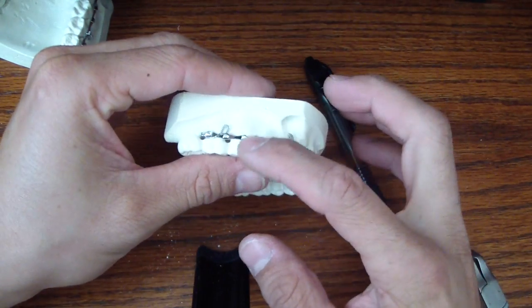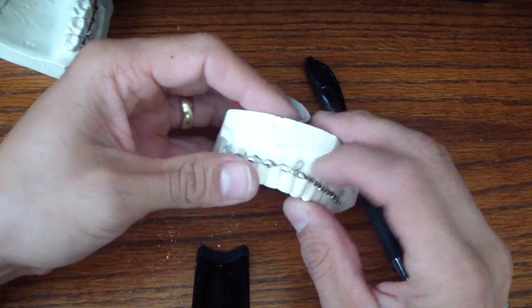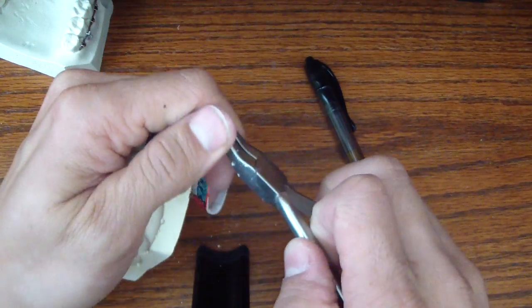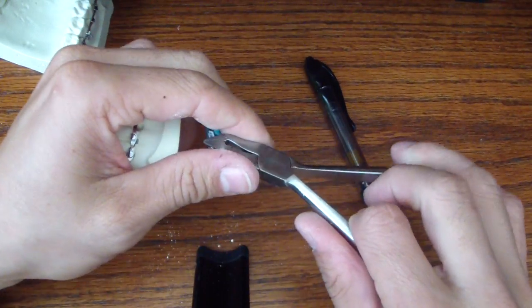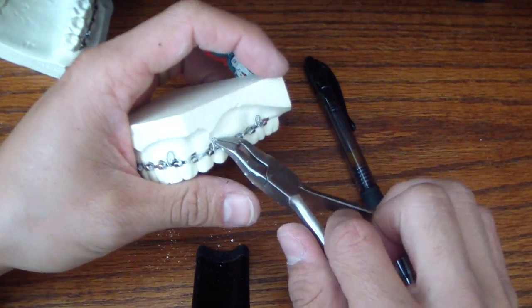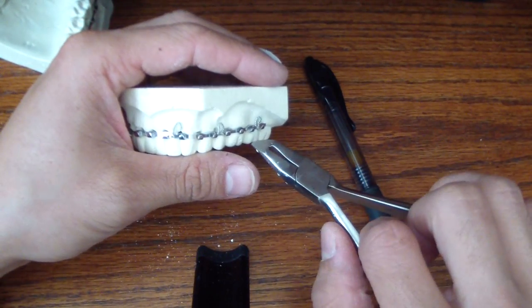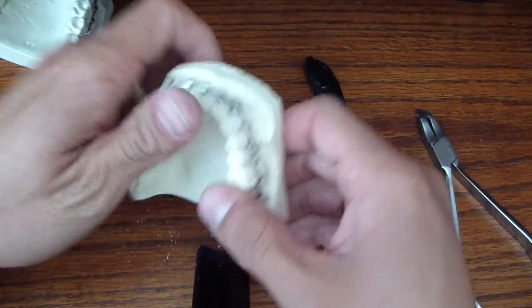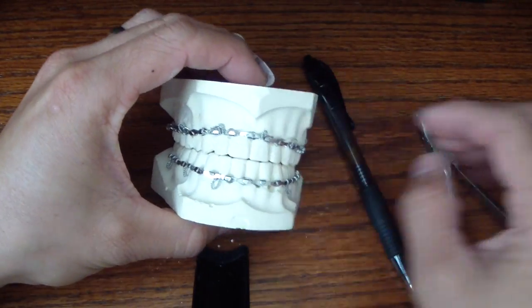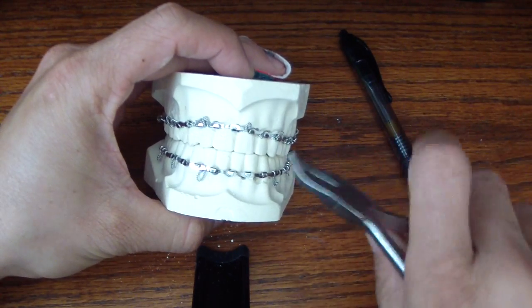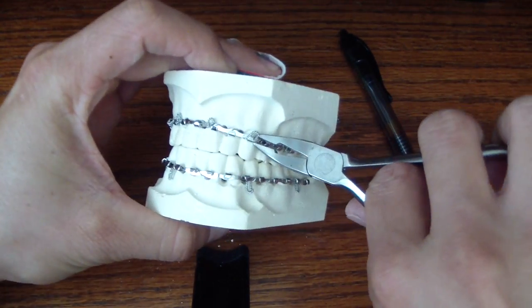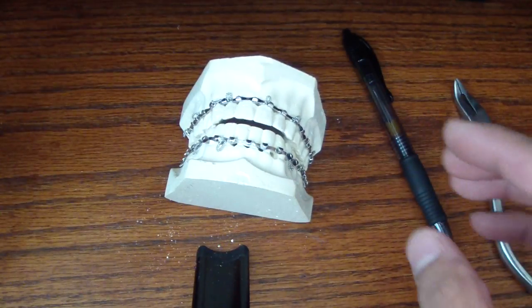I made my rosettes and we'd have a few more wires stabilizing this arch. These are orthopliers and if you have access to these, they make making rosettes much easier, even easier than a pickle fork because they're used for placing the wires. I'm going to double check that these are stable. Fairly stable.